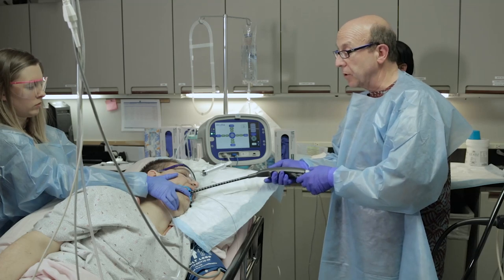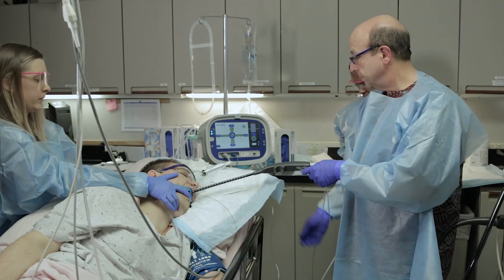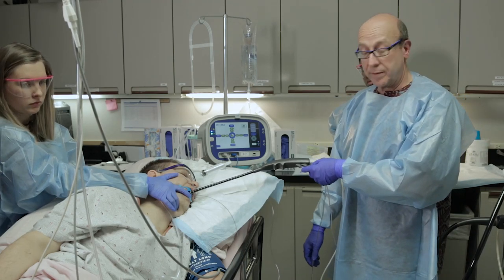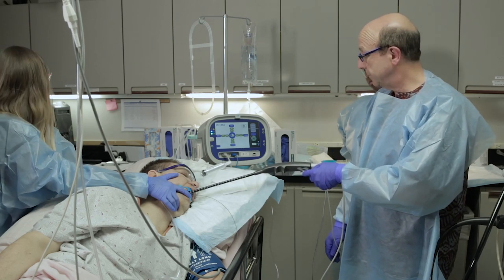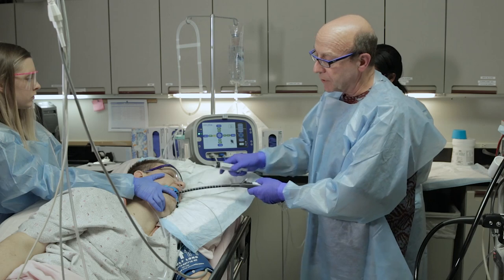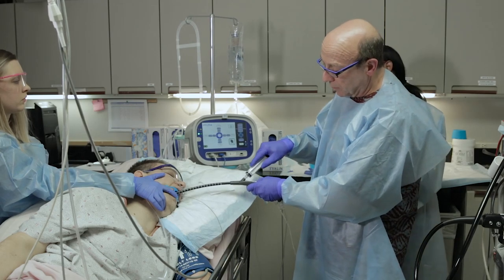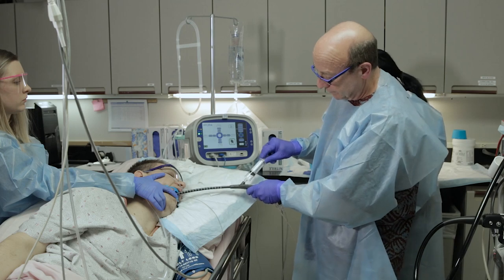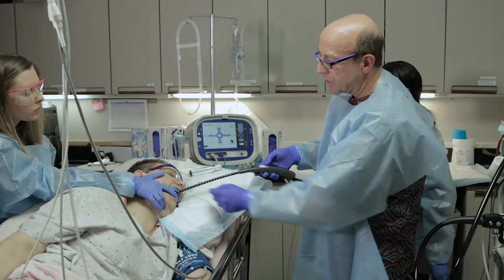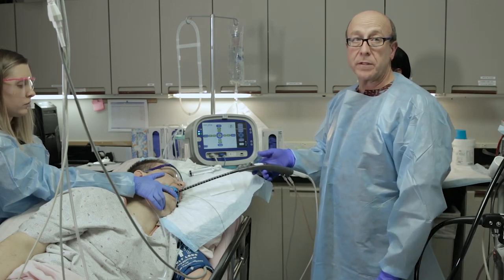This is the third and final rotational treatment at this level. At this point we've been working for approximately 12 minutes. We'll pull the needles back, insert the catheter down to that two-centimeter level, but now shrink the balloon size down to 22 cc's so we can pull the balloon a little bit higher into that junction — about another half centimeter more. We have three treatments at this level and then we'll be finished.